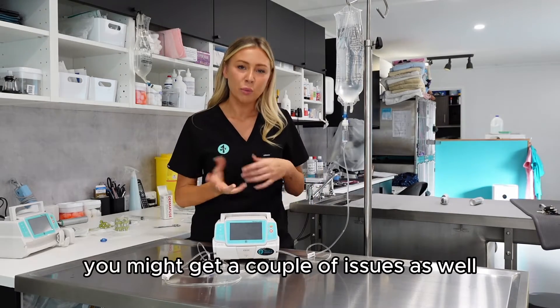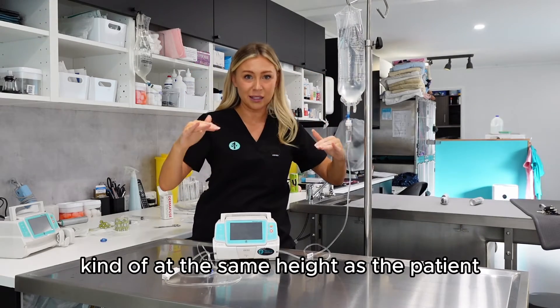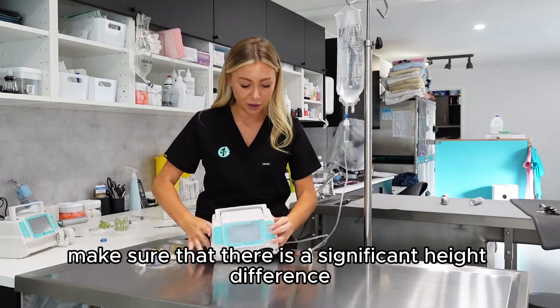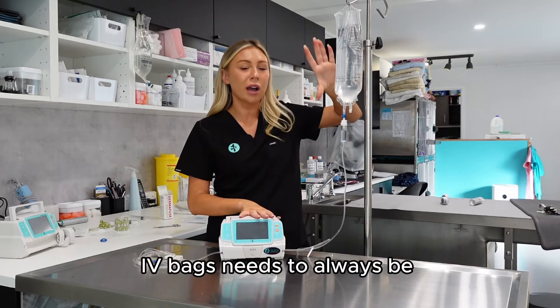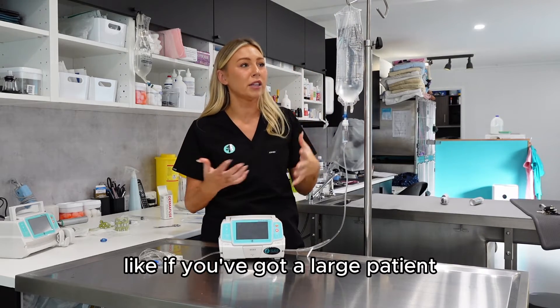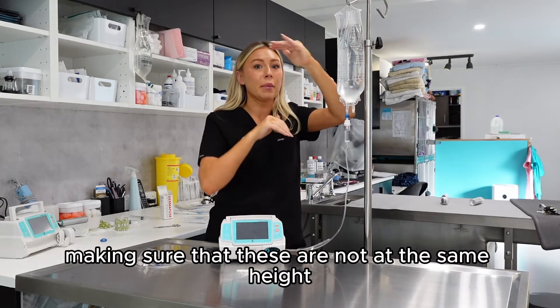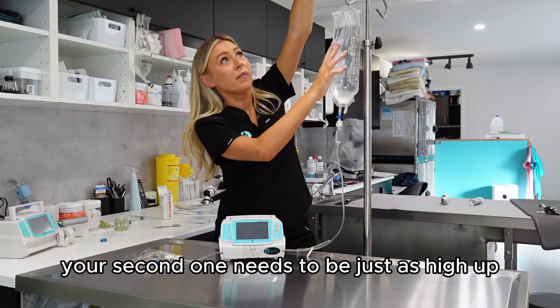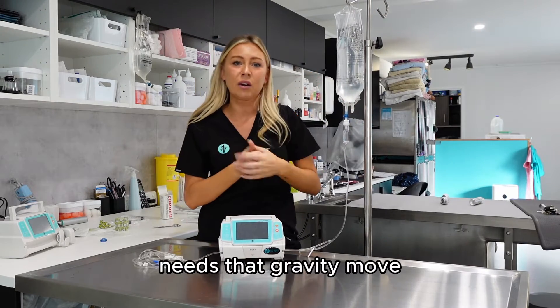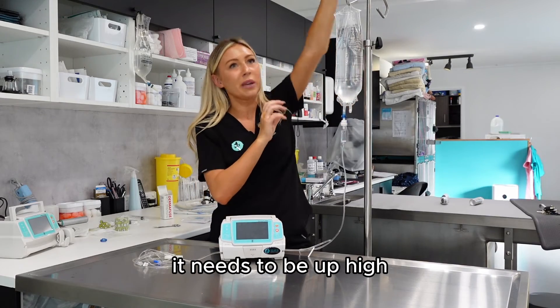You might also get issues if your fluid bag isn't high enough. If it's at the same height as the patient or the IV pump, make sure there's a significant height difference — the IV bag always needs to be up high. This is especially important when piggybacking: if you have a large patient staying overnight needing two fluid bags, the second bag needs to be just as high as the first so gravity can pull the fluid down. If it's at the same height, it won't move.